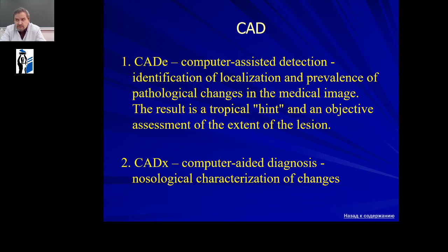The second group of CAD system is computer support for diagnosis. Computer-aided diagnosis. Nosological characterization of changes.